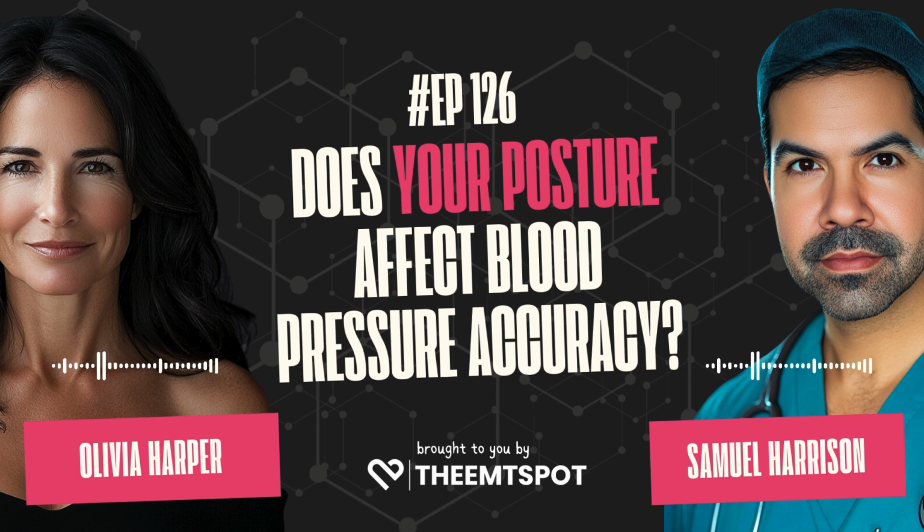Red flag. Oh, huge red flag. Remember that study we talked about in the Lancet Clinical Medicine? Dangling legs. Yeah, way higher readings. Right, 7 mmHg higher for the systolic and 4.5 for diastolic. Not a small difference. Not at all. And if you're leaning forward, your arm might not be positioned right at heart level, which can also mess with the reading. Okay, so what should I do in that situation?